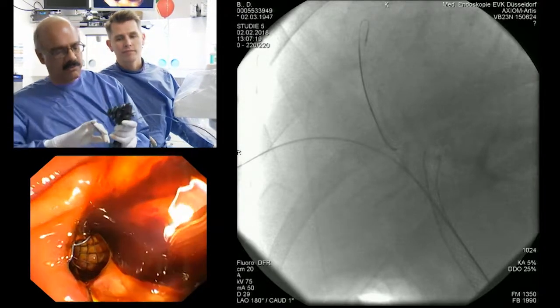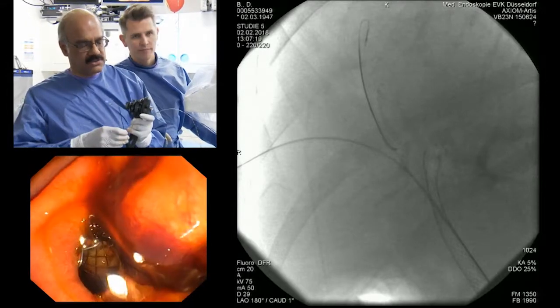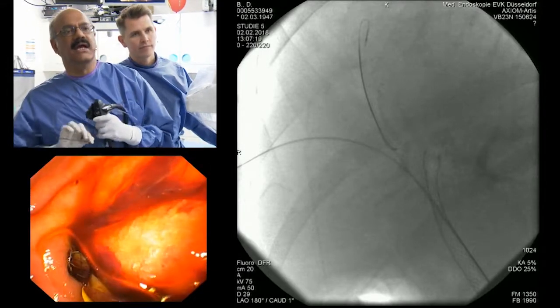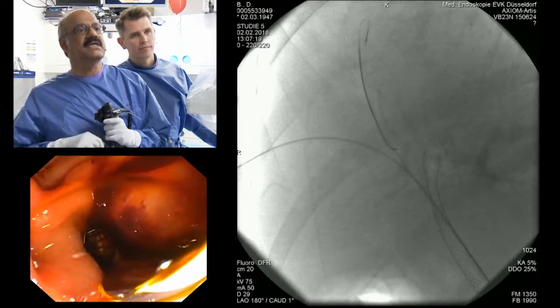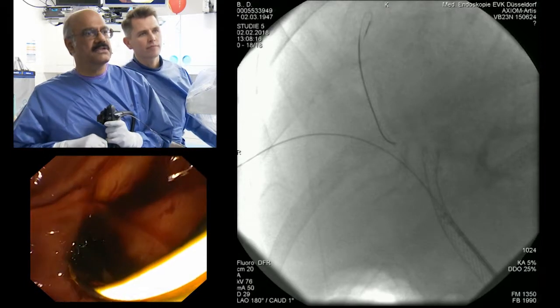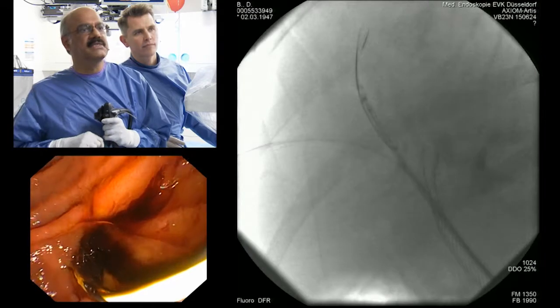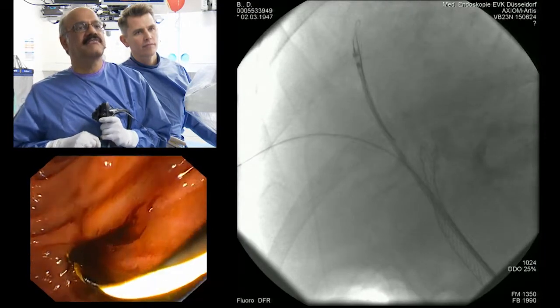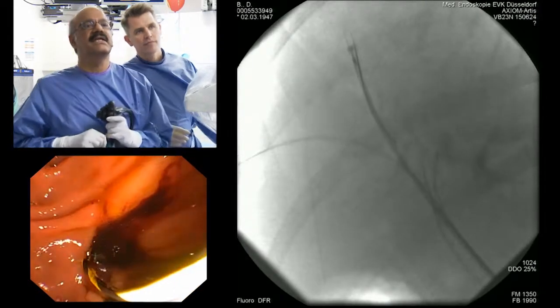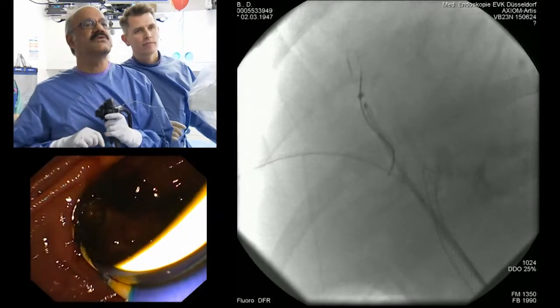The second stent I am going to put on my wire — this is on the right anterior duct — and I am going to use a WallFlex uncovered stent. You can see that as the stent goes in there is a little resistance, because already we have one more stent in place, so this is going to be a little more difficult. I am looking at the lower end because I want it to be just outside the papilla.